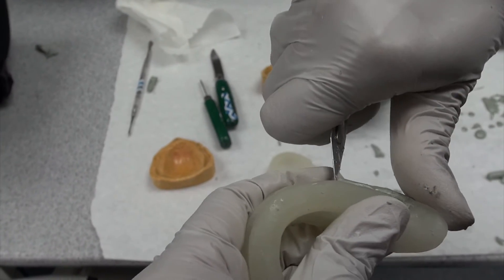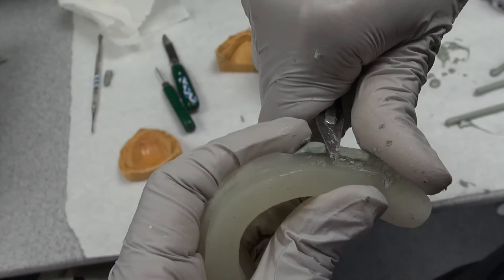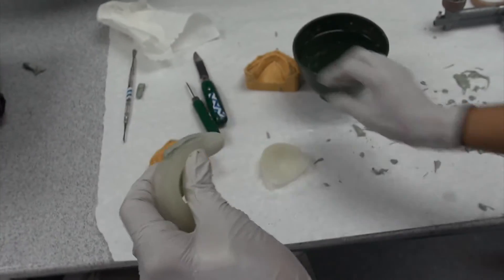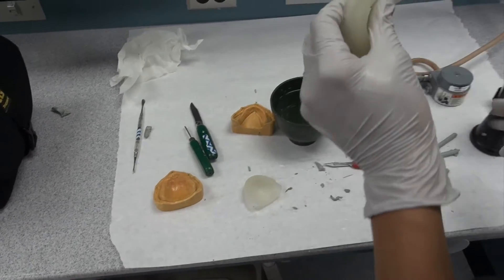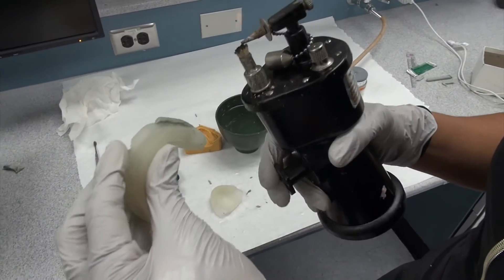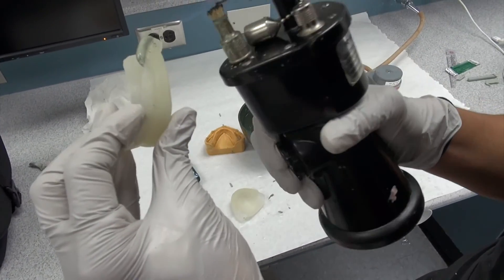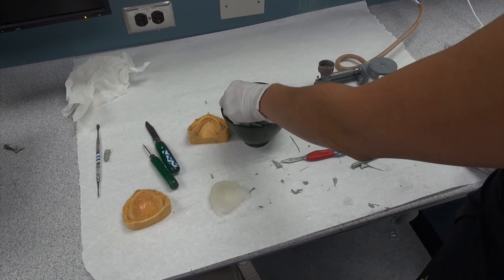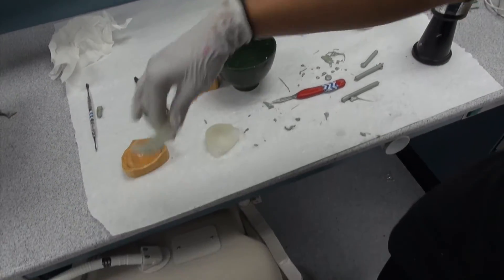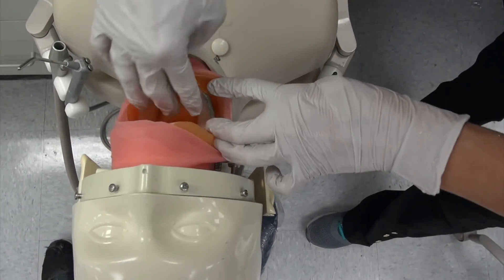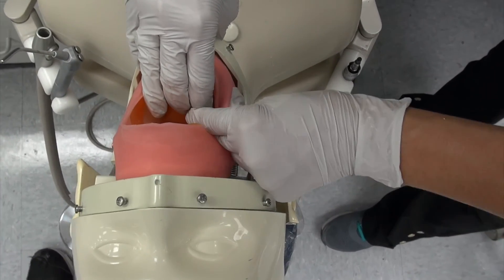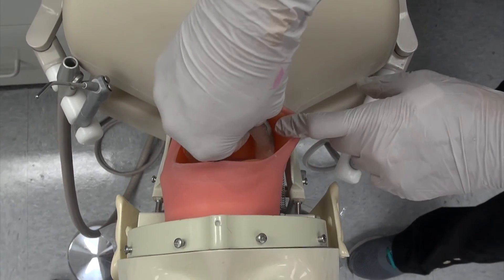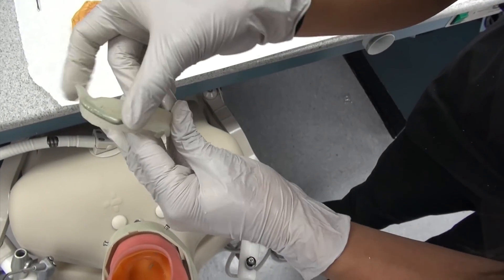And even take down some of the excess and scrape it away. And that's it. Nice and smooth.